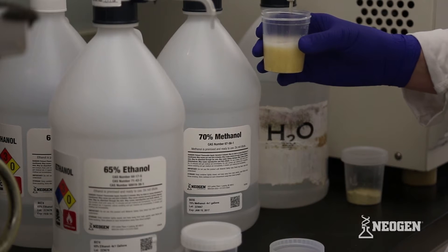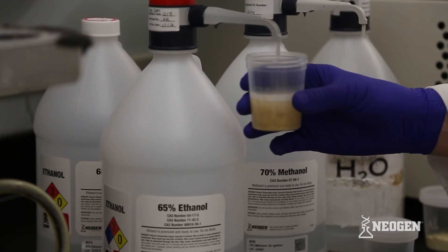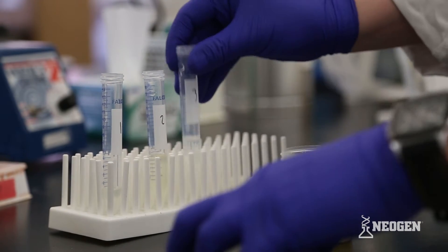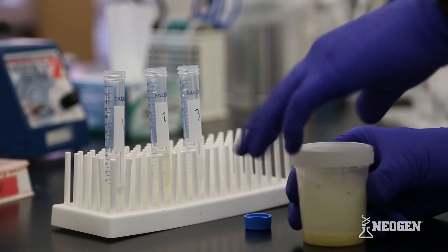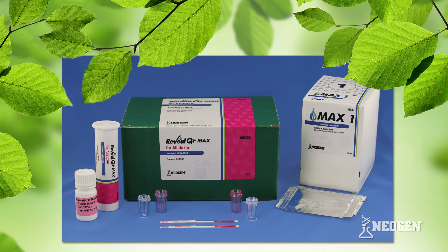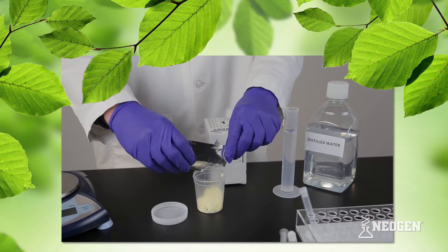Q Plus Max makes testing safer by saving your employees and business from the risks and expense associated with working with methanol or ethanol. They also save your technicians time by eliminating the need to perform multiple extractions on the same sample when testing for more than one mycotoxin.